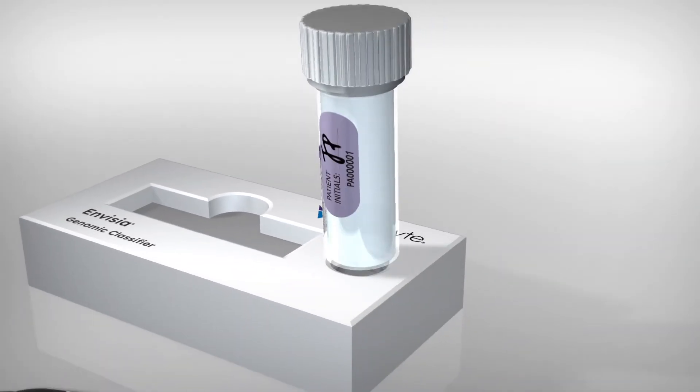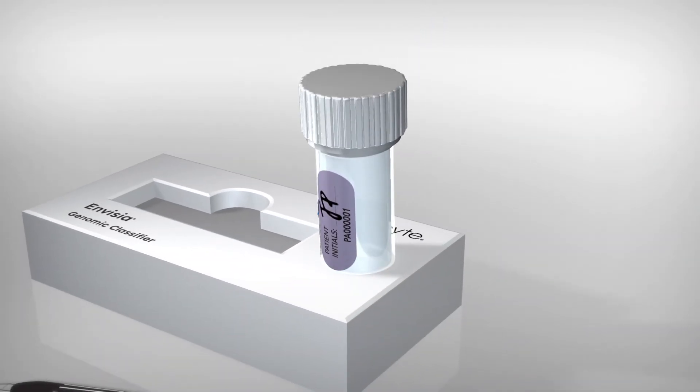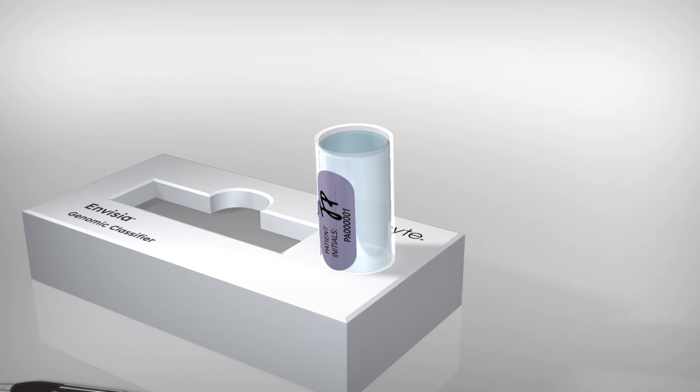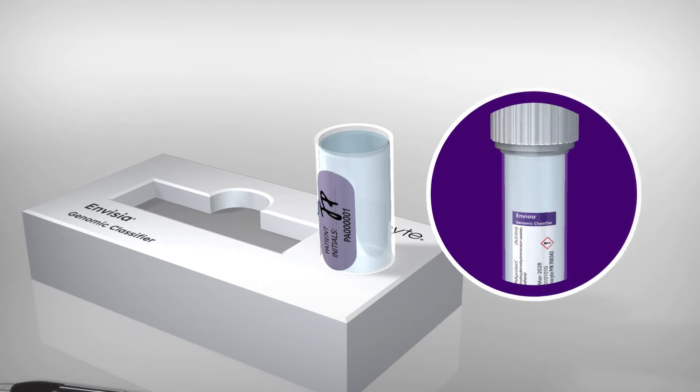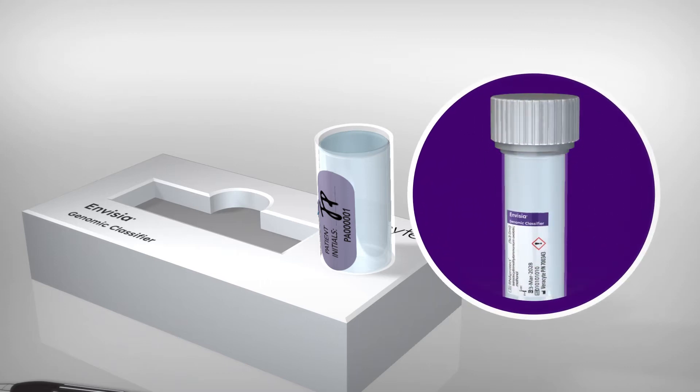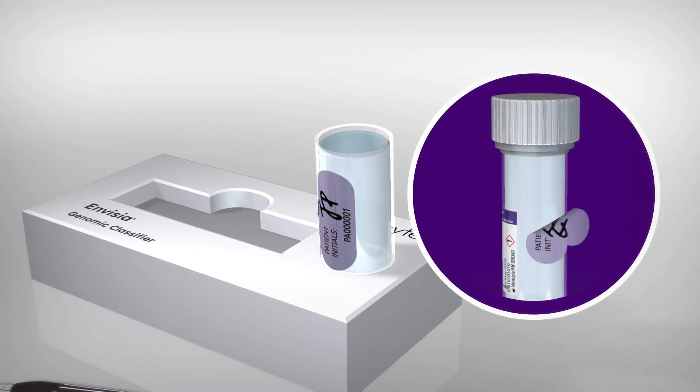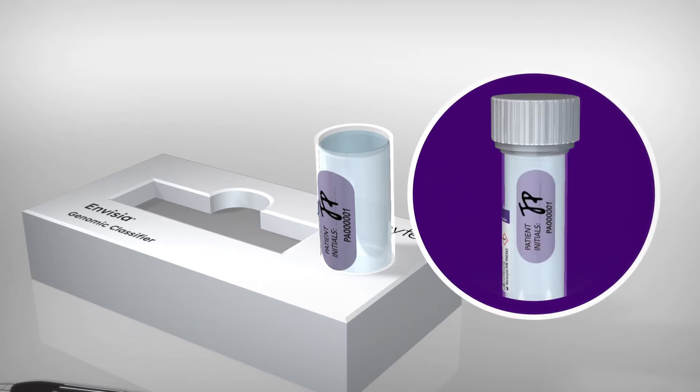Place the tube upright in the stand and unscrew the cap. Do not cover the expiration date or lot number when placing the label on the tube.